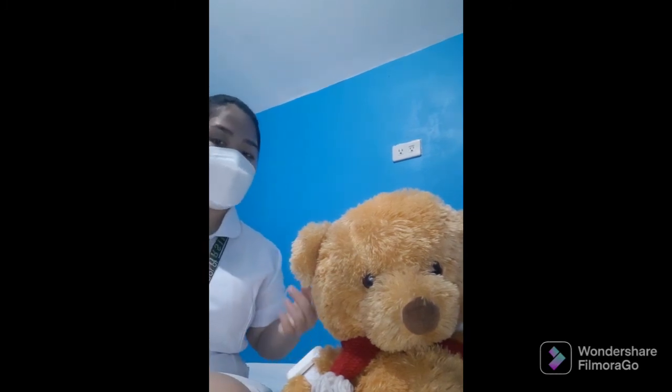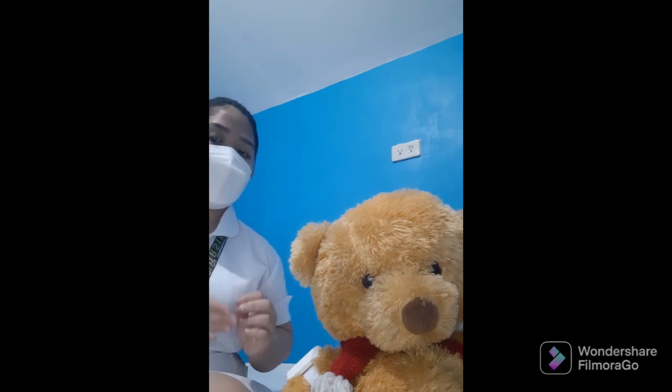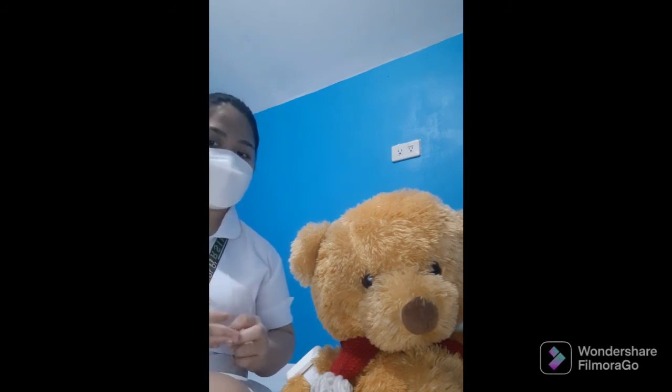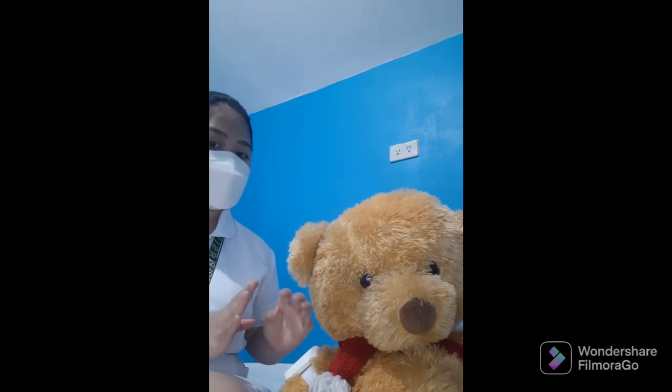Okay. So, next is we need to select the clean site. So, yung siselect natin is free from tenderness, hardness, swelling, scarring, itching, or burning, or localized infection. So, we need yung select nating site that is hindi po yung laging nagagamit. So, ito po yung ating site, yung sa arm po, sa likod po ng arm ng ating patient. Then we need to apply clean gloves.